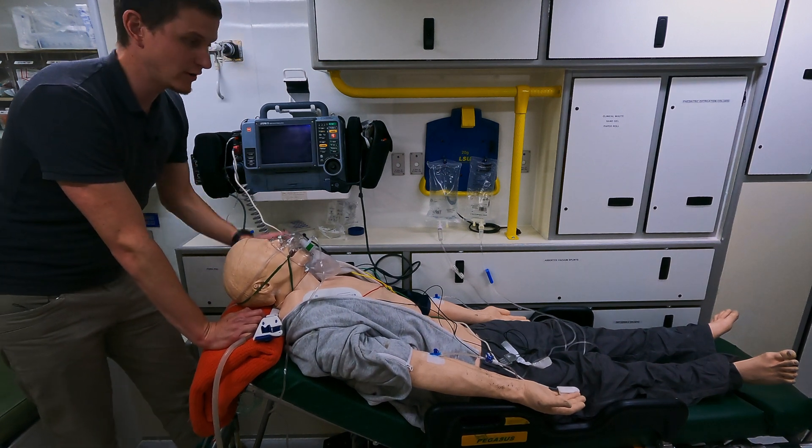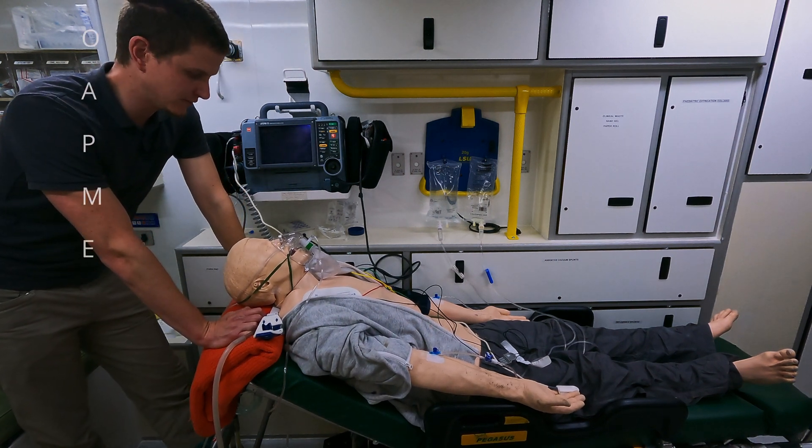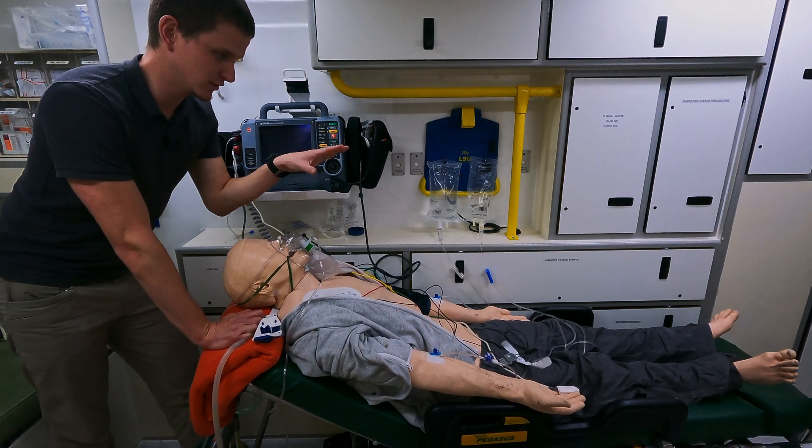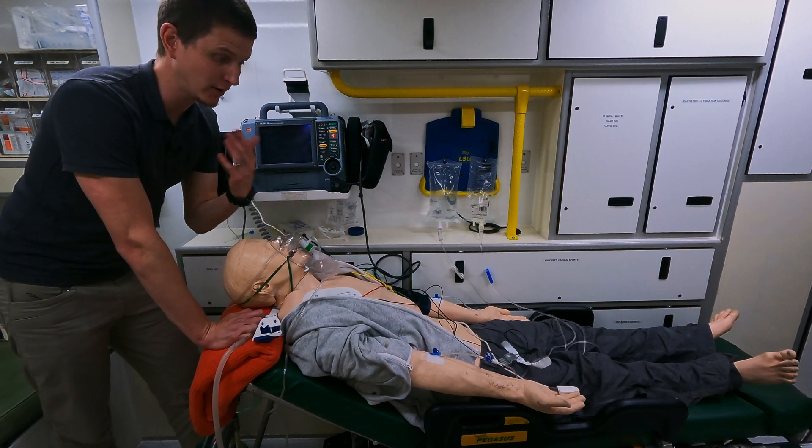We're going to go through a really important acronym called SOAPME. It's a really helpful little framework, and I'm going to keep this conversation to what kind of equipment I expect you to have as a paramedic who can't RSI.